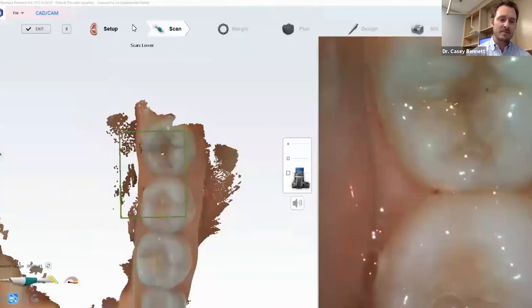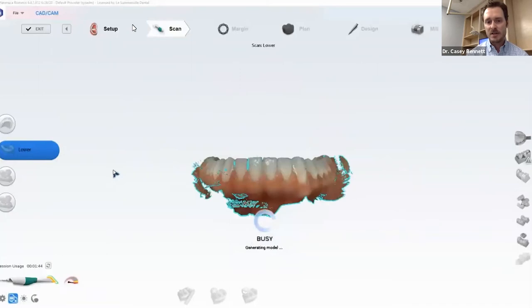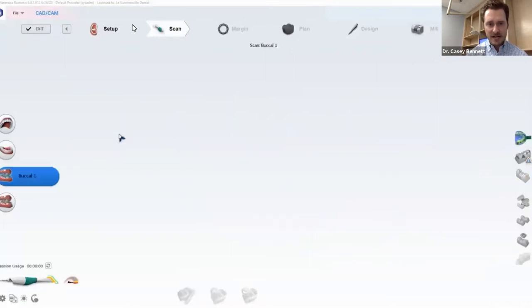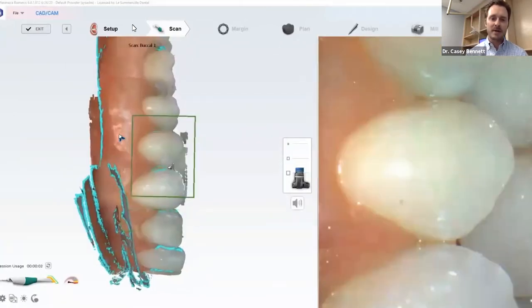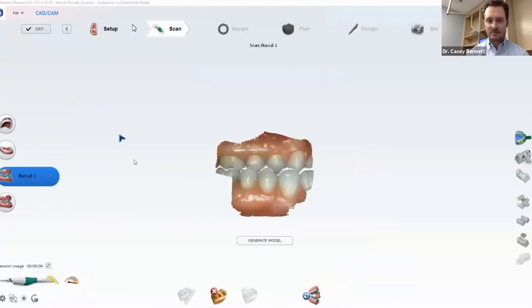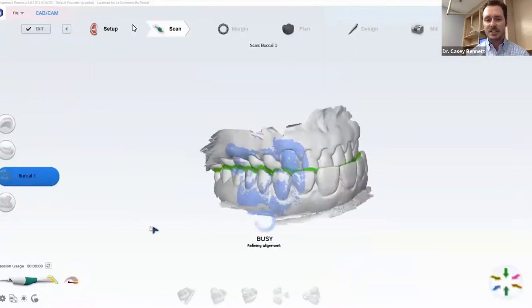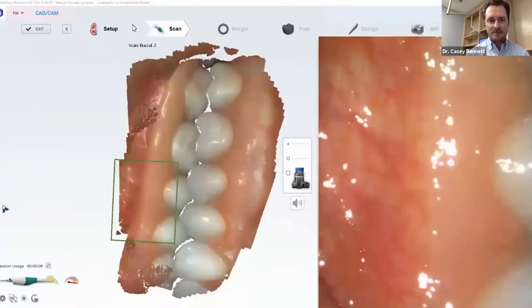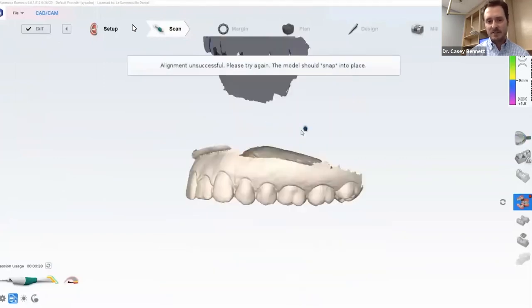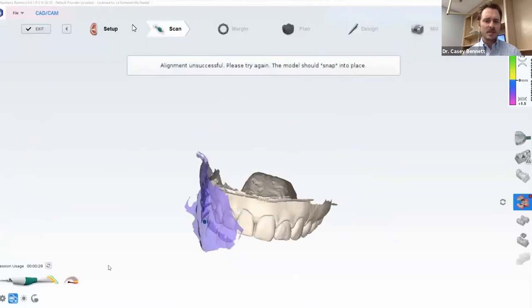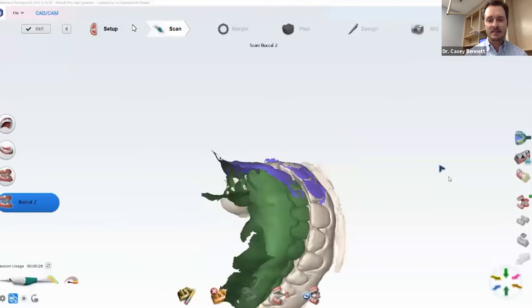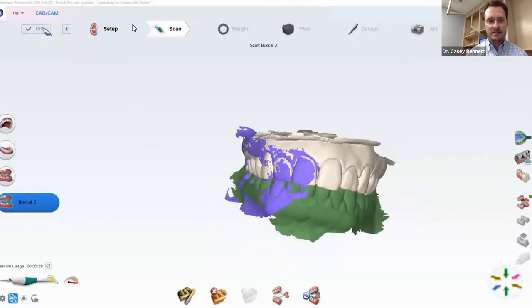I sped up the lower arch in the video because I didn't want you sitting watching me scan forever. It only took a minute and 40 seconds per arch, and that's me taking my time. Now getting the bite registration — I like doing a bilateral bite. The first bite stitched in eight seconds. The second bite didn't stitch automatically, which is actually a good example — you can manually take that bite registration and drop your models into it to align it. No worries if it doesn't automatically stitch; it normally does.